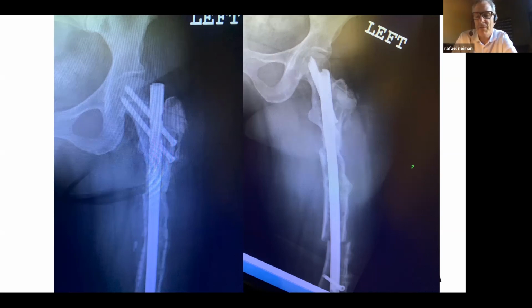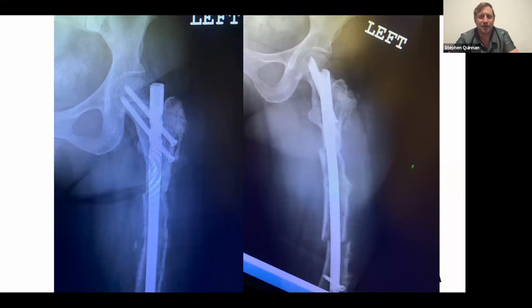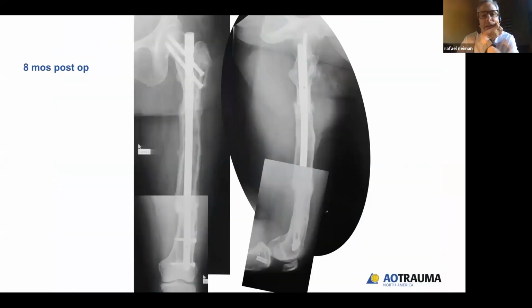But as Mark said, maybe I should have been a little more aggressive with the lamina spreader, osteotomes, and a pair of pliers. I would say on the other side, though, that the downside in this case of having more spread is that you're going to have a bigger gap between some of your bone segments on each side. So there is a balance between having a little more strain versus having a little more gap at the ends. Those both have pluses and minuses. In theory, this is going to be a little more load sharing than one that has a longitudinal split down it.